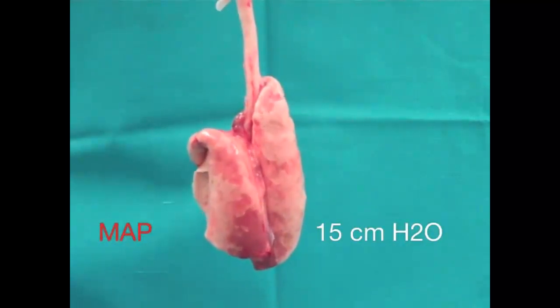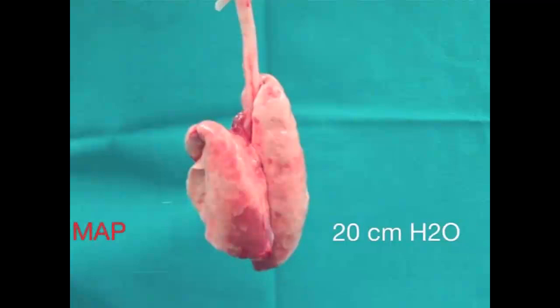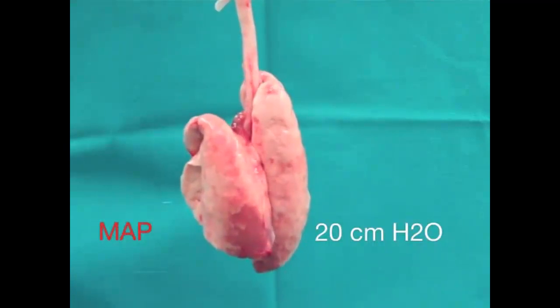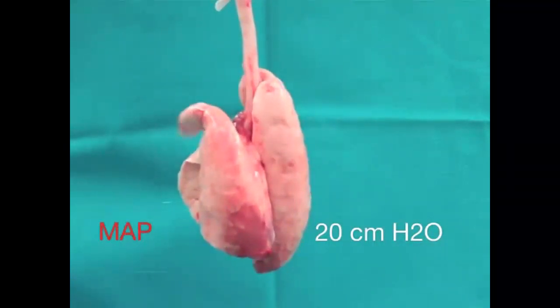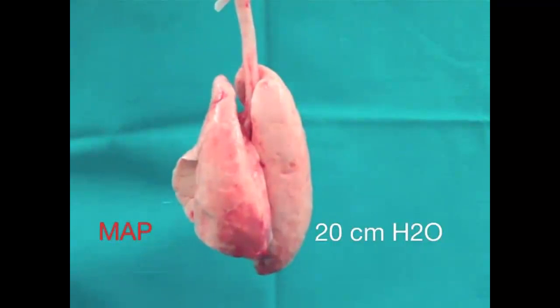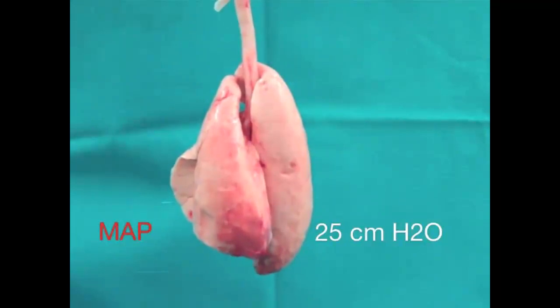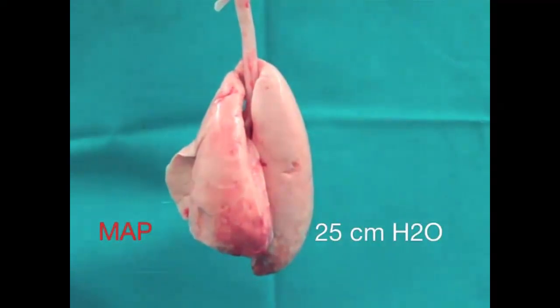You can see how there is no effect on the lung volume at 15. Now we are going to increase this pressure over 15, and you can see how after a few seconds there is some increase in the lung volume of the animal. And now at 20 you can see how there is some kind of recruitment, and most of the lung is recruited. If we go up to 25, then we will have even more recruitment of the lung.